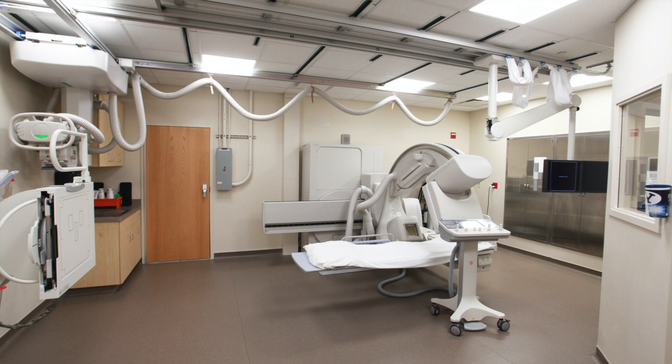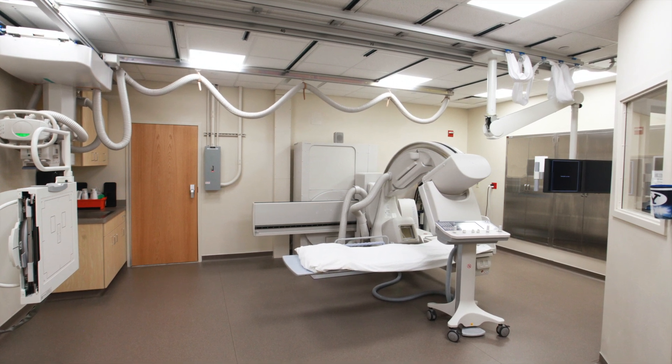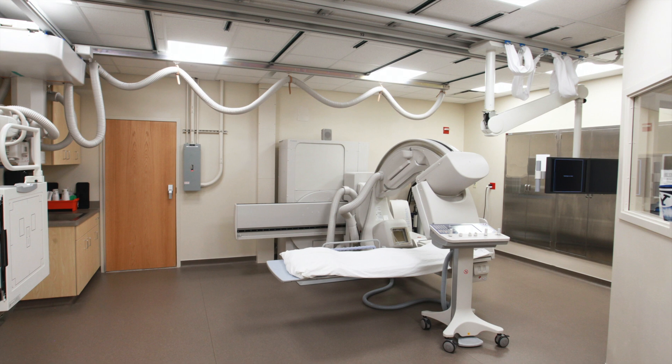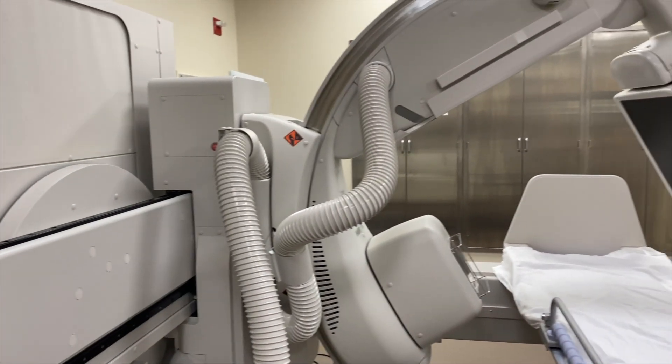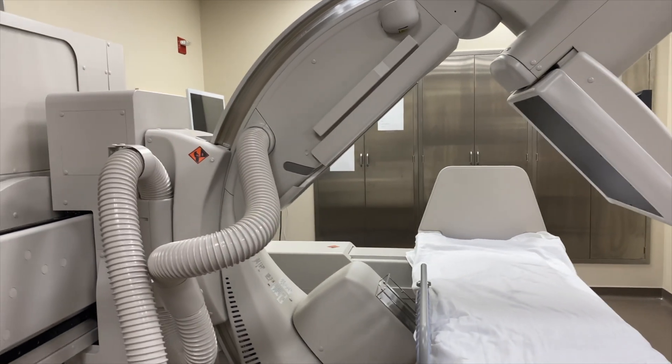My name is Kristen. We have our new and improved fluoro room. It also does live x-rays and we can do procedures — joint injections to enhance imaging, steroid injections to decrease pain in joints or in the spine.